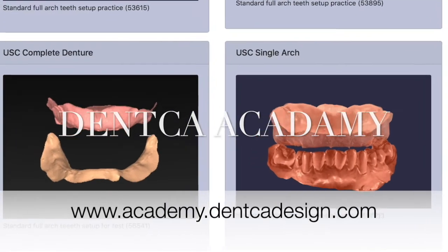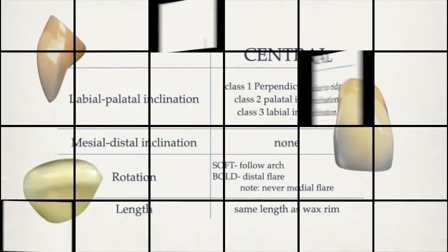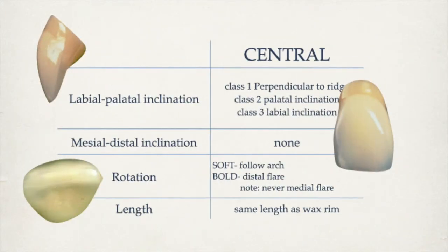You could make a login with your own information. Starting from central teeth does require specific inclination in XYZ location. Class 1, 2, or 3 jaw relationship makes the labial-palatal inclination different. Class 1 will be perpendicular to the ridge, Class 2 palatally inclined, Class 3 labially inclined.